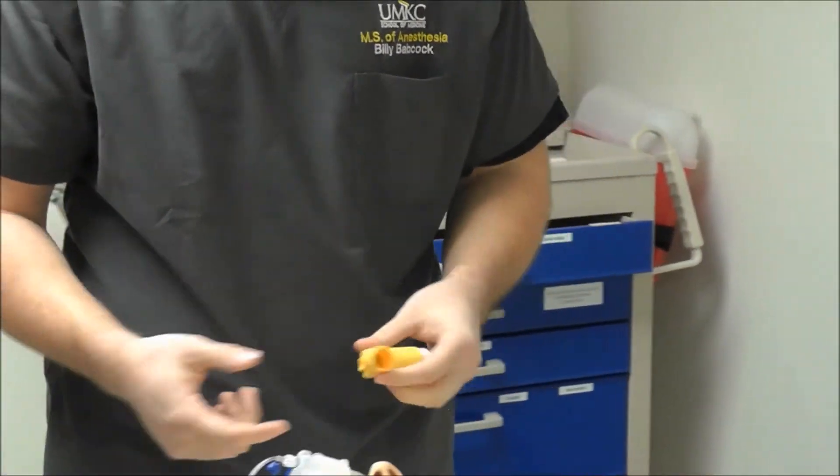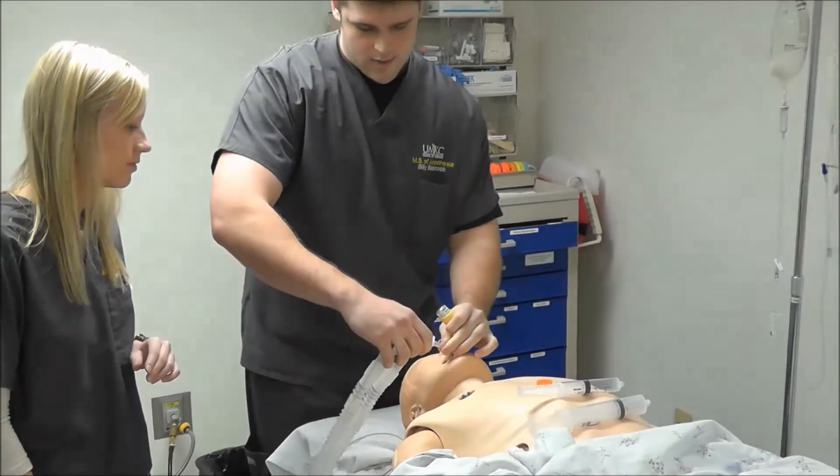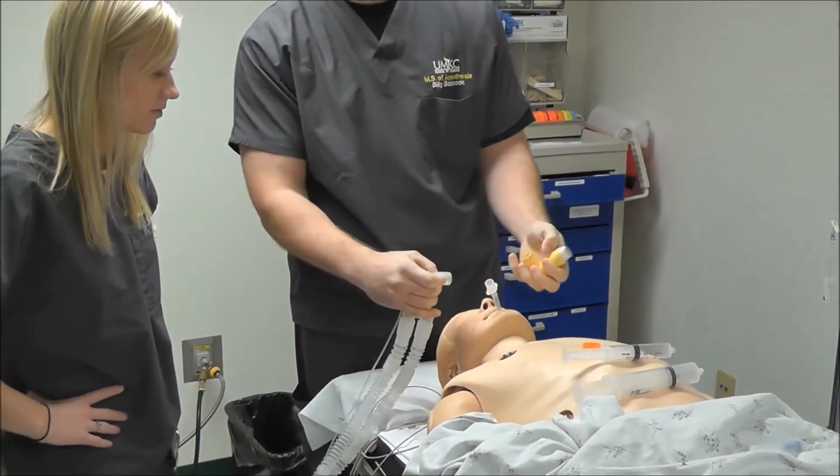We want to go ahead and give it through the endotracheal tube. If we try to do it without using a syringe, it's too big and it won't fit.